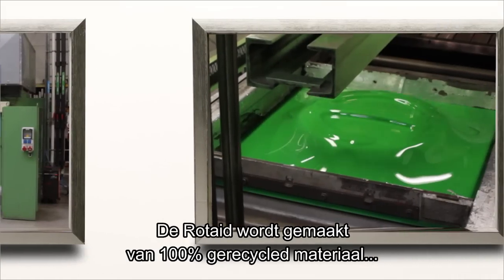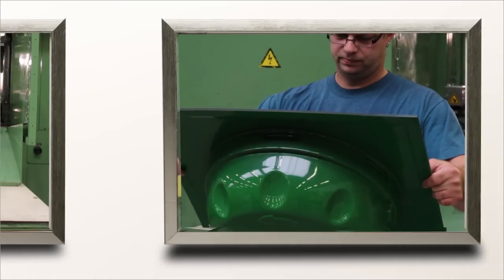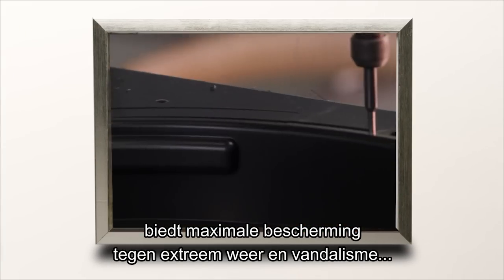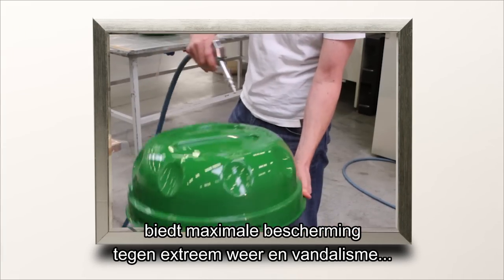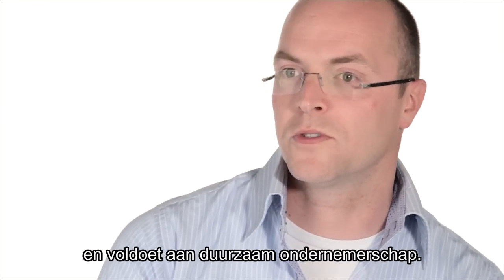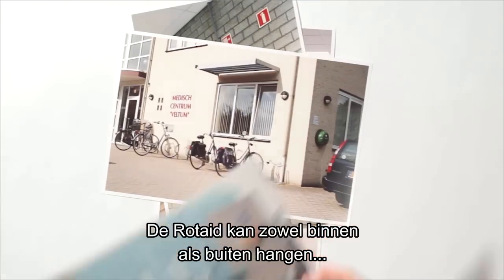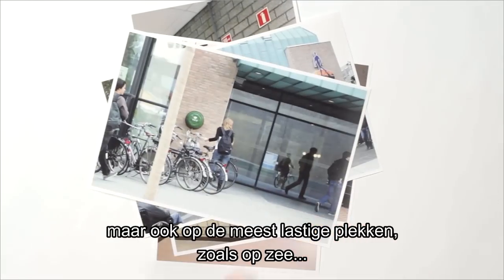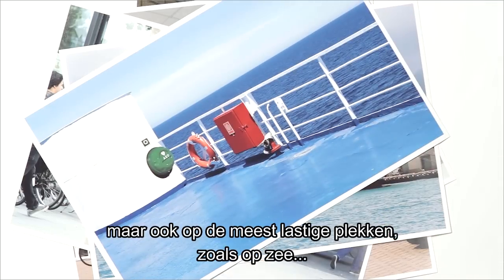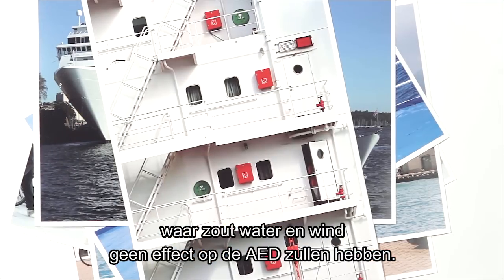The Rotaid is produced with state-of-the-art technology and 100% recycled materials, offering maximum protection — for example against weather conditions or vandalism — without ignoring our corporate social responsibility. The Rotaid can be placed indoors and outdoors, but also in the most challenging environments, for example at sea, where salt water and wind have no effect on the AED inside.